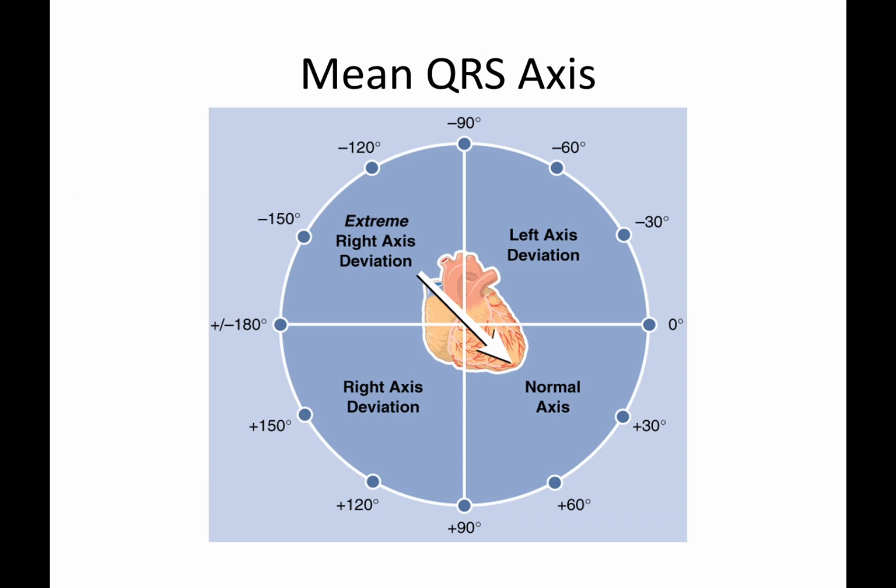So when you lay all of these out, you actually can start putting a larger picture together. You have your handout, you have your front page, and on there it has this picture. So please see your handout to look at this. In your handout, normal's normal, right? This makes sense. Your 2 lead is right here, and so this is what a normal vector should look like, and it should fall within this quadrant on this layout.